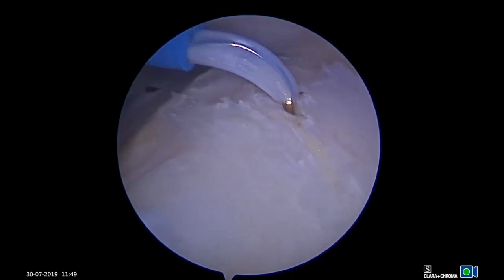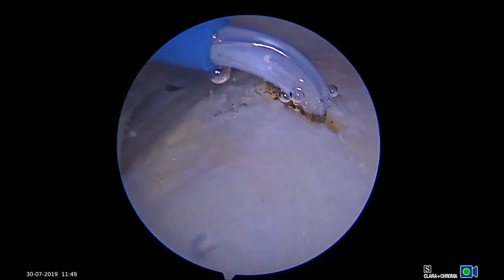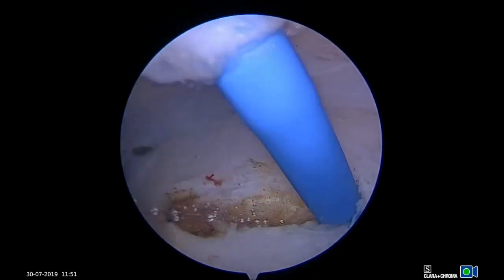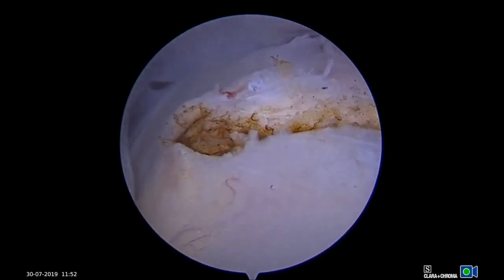Through a high lateral portal, a hooked electrocautery is used to make a 1cm longitudinal split in the tendon about the tear site. We prefer to use this electrocautery as it makes a narrow hole in the tendon and minimizes tissue damage. Alternatively, a beaver blade may be used.